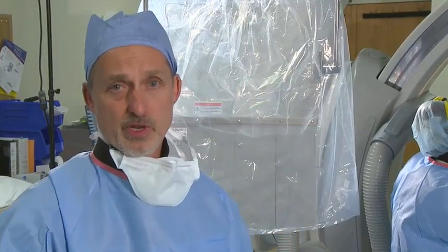And the three-dimensional aspect of the imaging really helps in terms of understanding the anatomy of the atrial septal defect, but also during the actual deployment of the devices in terms of the alignment in 3D space of the left atrial disc, and then to do a quick, efficient interrogation of whether we have rim capture, whether we have residual leaks, whether we have any issue with the device interfering with contiguous structure.